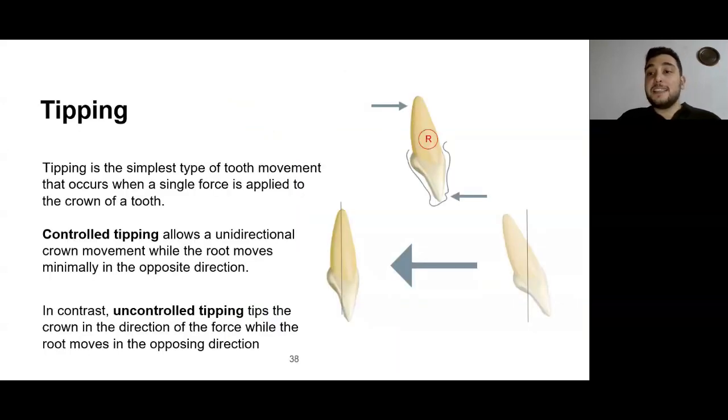So by now, let's establish that tipping is a side effect that happens with aligners, and we're going to learn how to avoid it, or how to work our way around it. There are multiple ways to work around this side effect and use it to your advantage. But this is how we learn with aligners, that the initial side effect is always tipping.